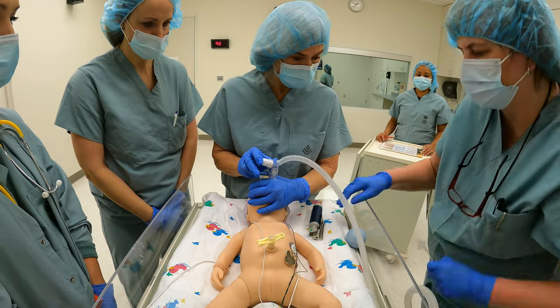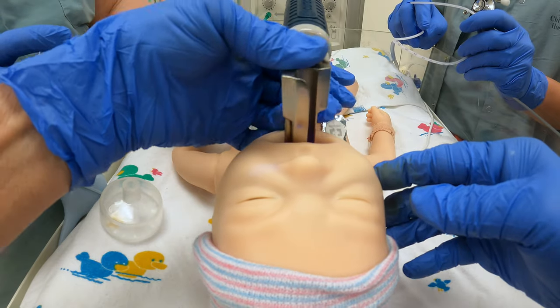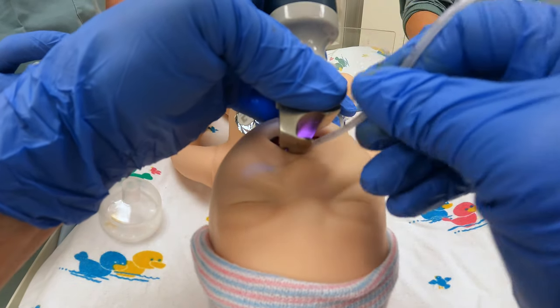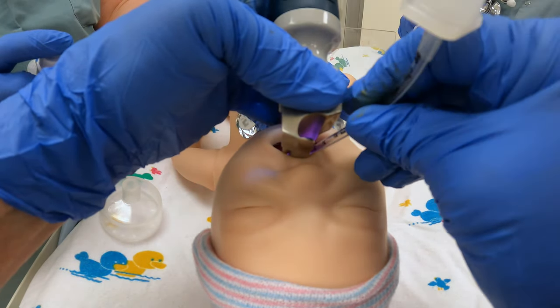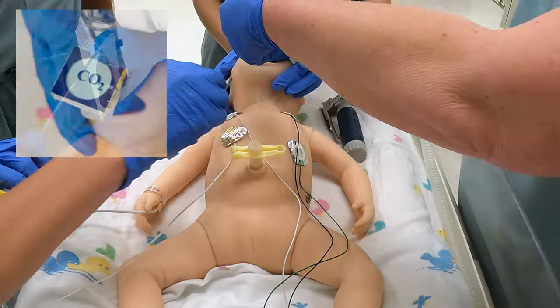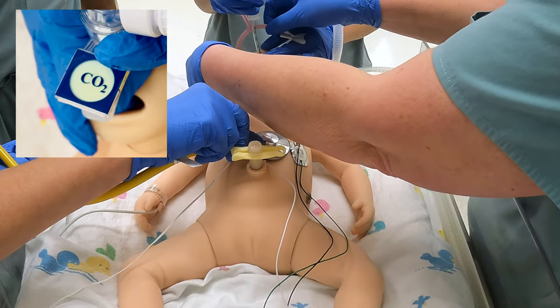I'm ready to intubate. I have your blade and handle here, and I have your ET tube. Okay. I have a lot of secretions. Can I get some suction? Can I get some cricoid? Holding cricoid pressure. Okay, I see the glottis and the cords now. Okay, I see the tube going through the cords. Great, we have color change and the chest is moving. I hear breath sounds equal bilaterally and nothing over the stomach.